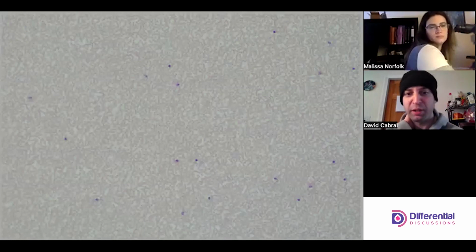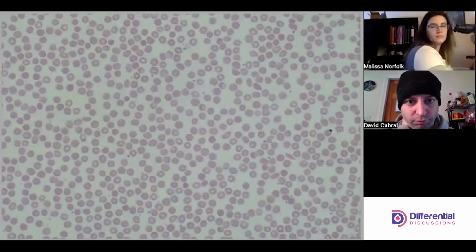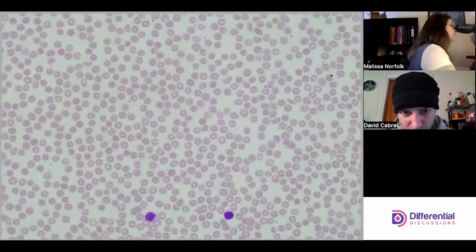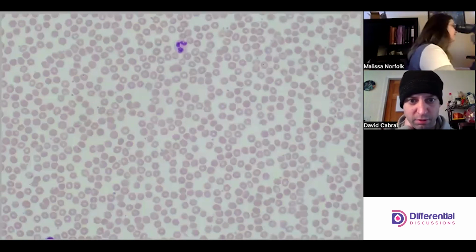Yeah, I think we can go down to our higher mag when you're ready. I'm going to pay close attention to the lymphs because they were elevated.